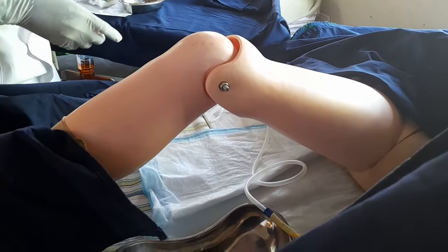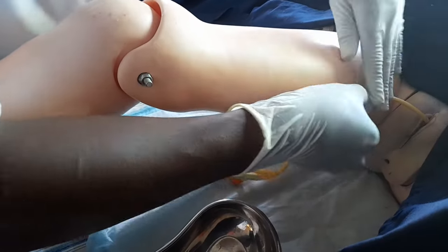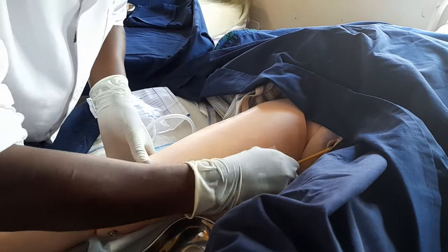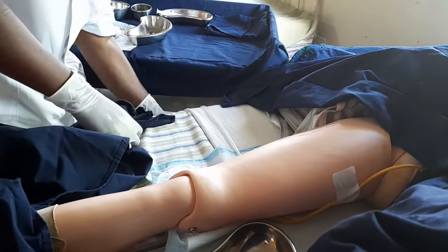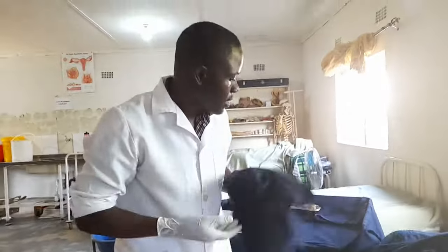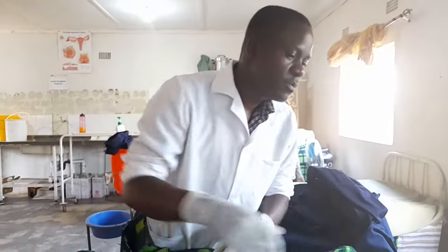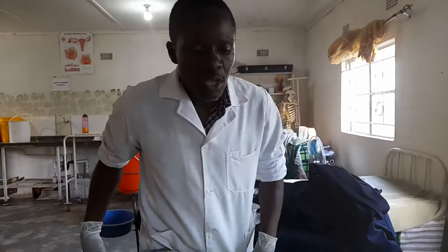Now secure the catheter. Get your strapping and secure the catheter on the thigh so there is no pulling and no irritation. Ensure the woman is comfortable by securing it nicely. Secure the urine bag underneath the bed by tying it. Catheterization is now done. Remove the drapes and the linen. Tell the patient: 'Mrs. Mwape, I've catheterized you — ensure that you do not pull the catheter, as it is helping you to drain urine so that you are comfortable and don't soil the bed.'